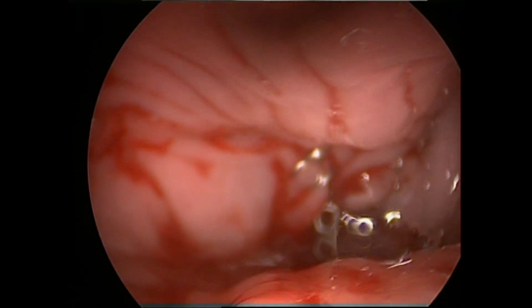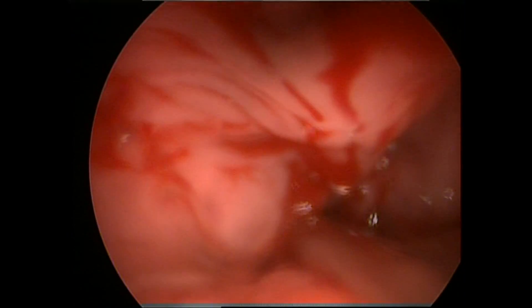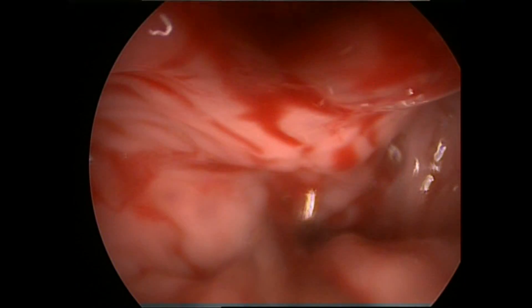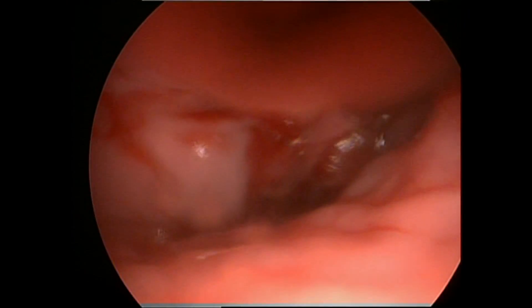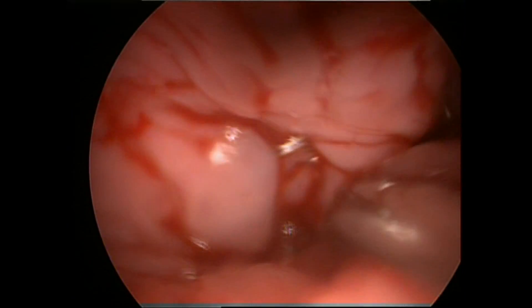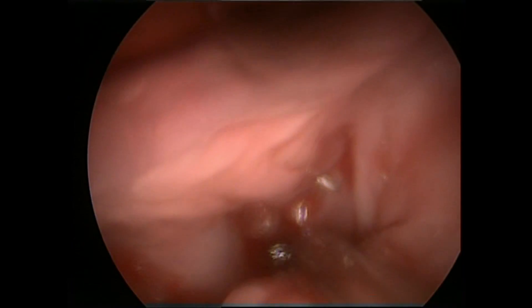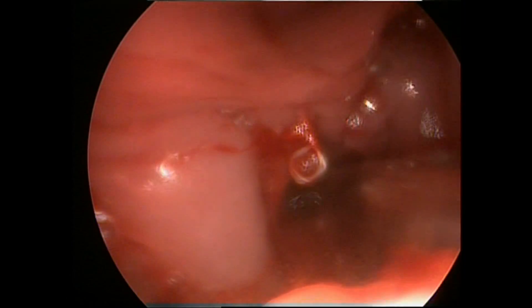At this stage, as you can see, the process of cutting and stapling is completed and we'll have to make sure that the cavities have unified completely and there is no dehiscence in the wall. The procedure can be considered completed as the cavities have unified and the walls are tightly stapled.